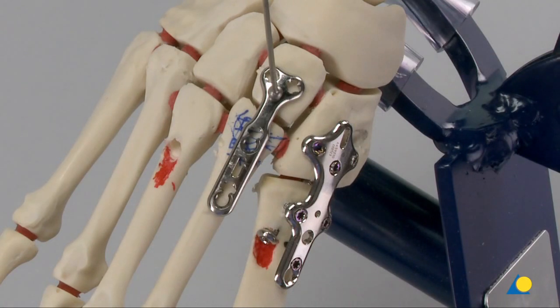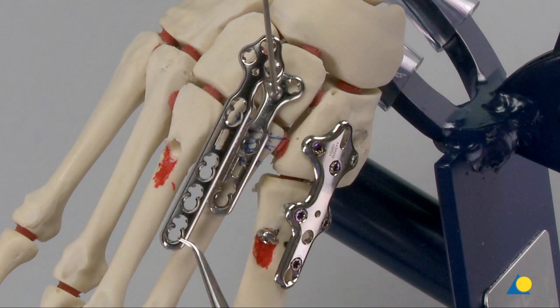A TMT fusion plate 2.4-2.7 VA locking has been secured to the second ray using a compression wire. A comminuted area is indicated in blue at the base of the second metatarsal. In this case, the TMT fusion plate would be inappropriate as the most proximal screw in the distal plate segment would fall into the comminuted area and would not obtain purchase in the bone. A longer plate would be needed to cross the comminuted area and allow for sufficient screw purchase in the distal plate segment. Here, a T fusion plate 2.4-2.7 is shown.